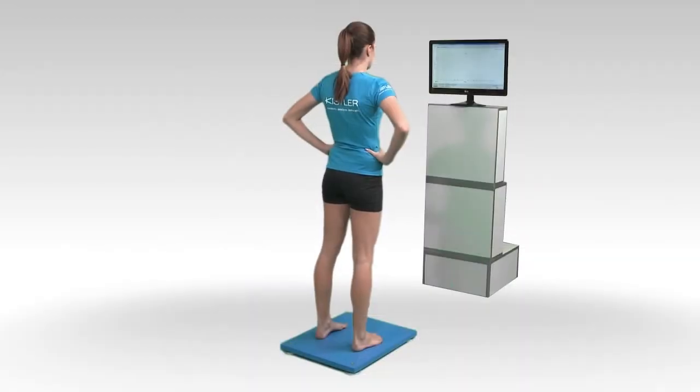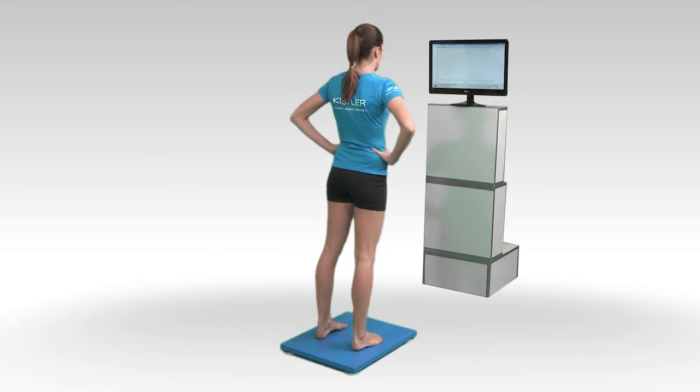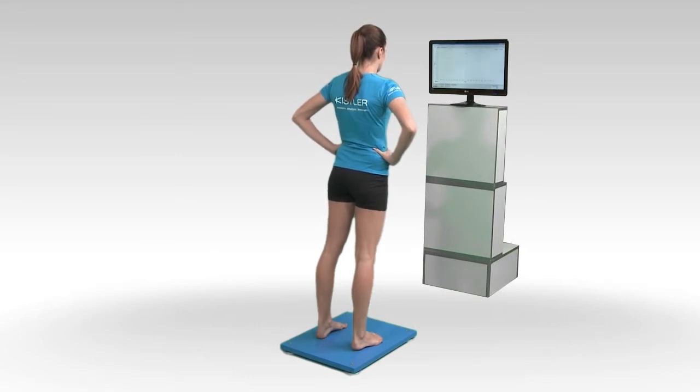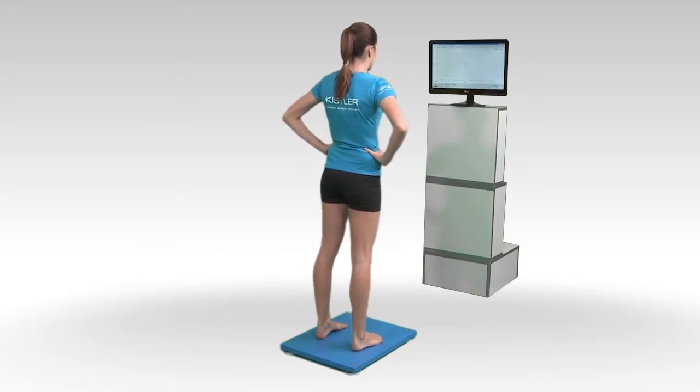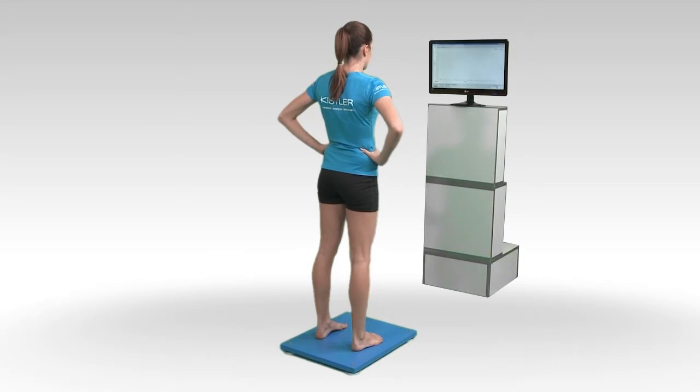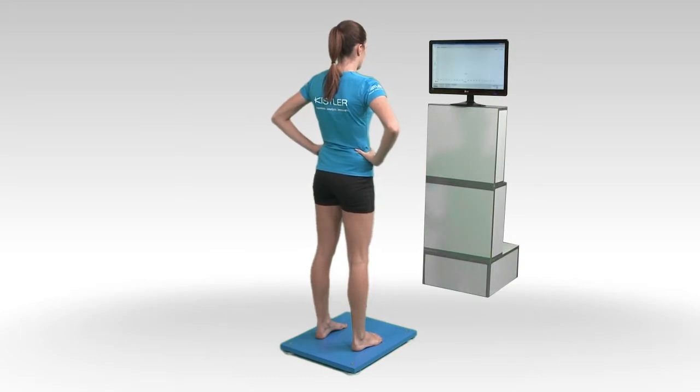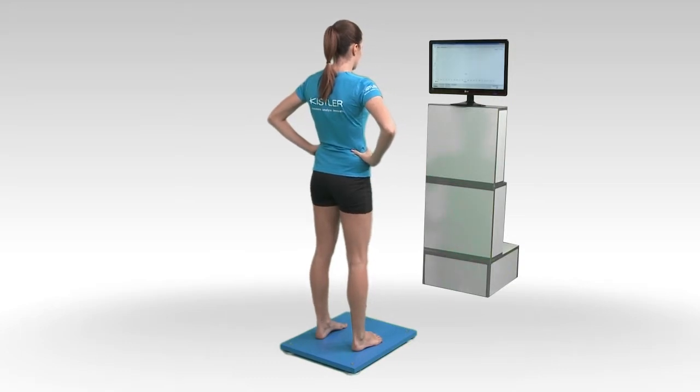Based on the measurements of the subject's limits of stability, specific characteristics of the other test modules, like shape and curve tracking, are defined.